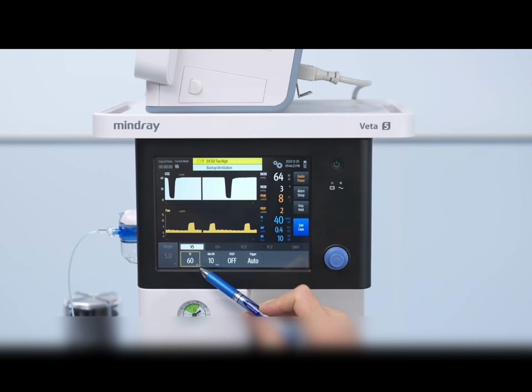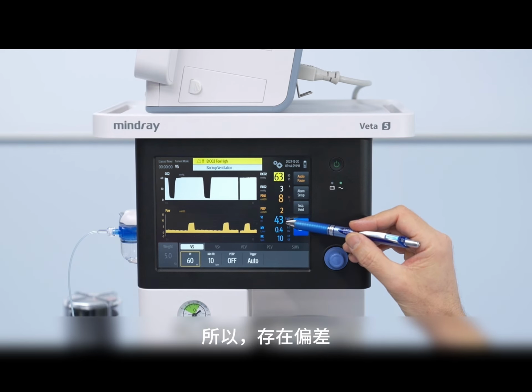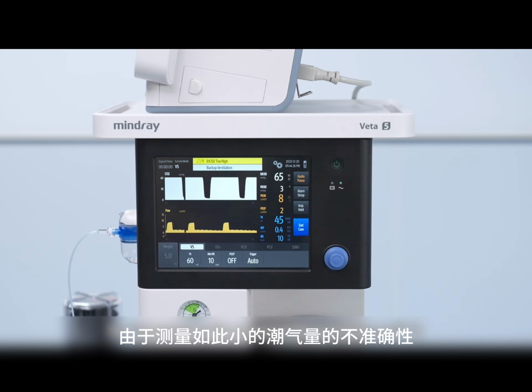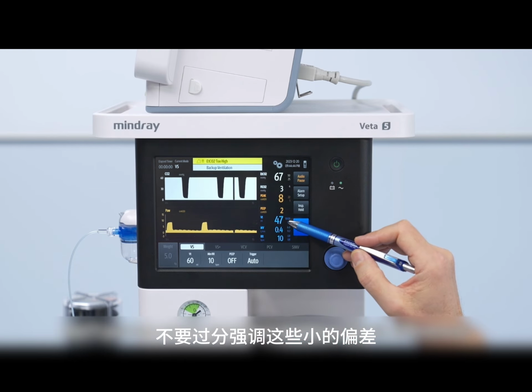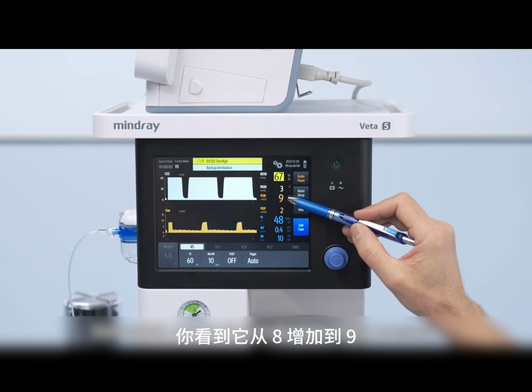Okay, we set the tidal volume to 60 and we got 40. So there is a discrepancy. The discrepancy is partially explained by inaccuracy in measuring such a small tidal volume. So in such cases, don't put too much emphasis on these small differences, but watch out for the peak inspiratory pressure. As you see, now it increased from 8 to 9.